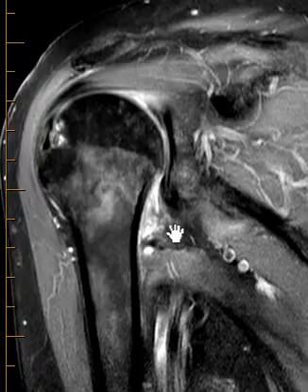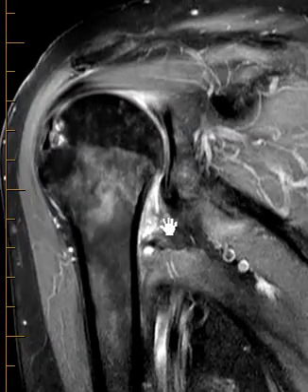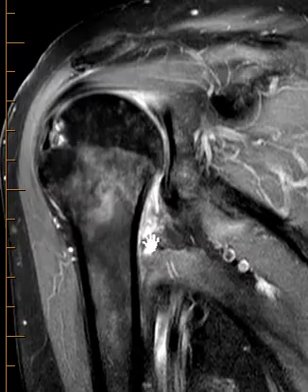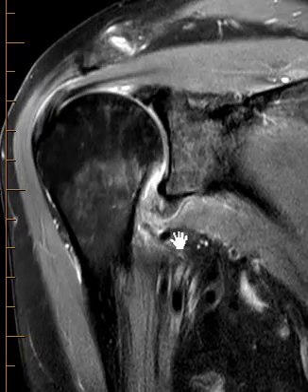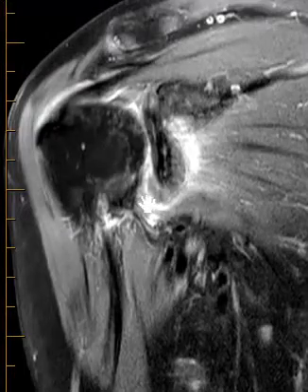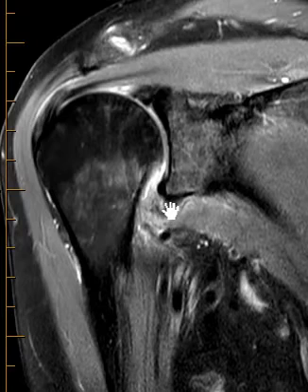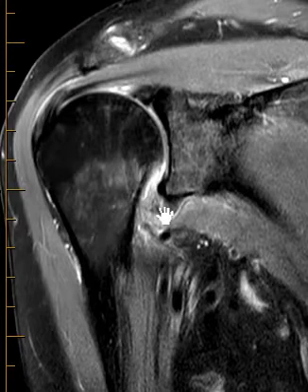If we march backwards, we don't really see that posterior band — the posterior thick part going in here attached — so it looks like it's torn from the humeral attachment posteriorly. And at the midsection, if we go anteriorly too, I just don't see this coming over to the humerus. So it looks like a tear of the humeral attachment of the inferior glenoid and humeral ligaments in the joint capsule.